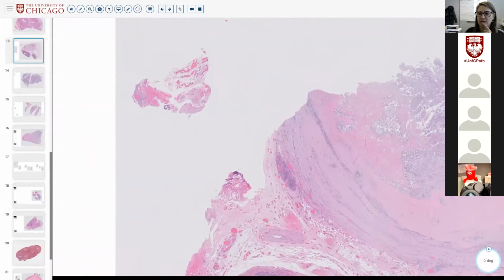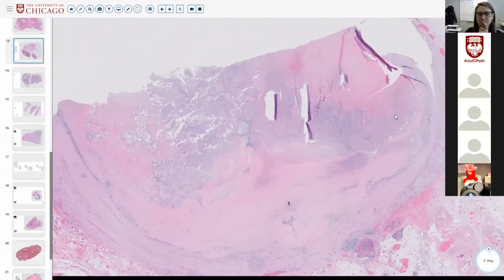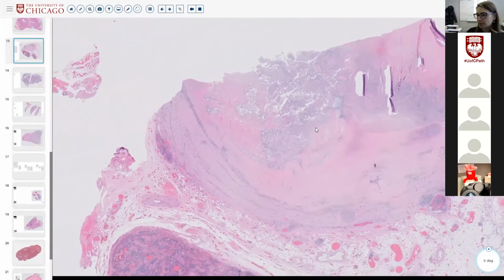Treatment effect? Future cytopathologist. Oh, it's been biopsied before, and that's why it looks kind of funny. Right. So right, I also see rapidly growing. So we'll talk about the difference between tumor necrosis from rapid growth and biopsy necrosis. And so this is biopsy necrosis. So this lymph node was FNA'd and it completely infarcted.